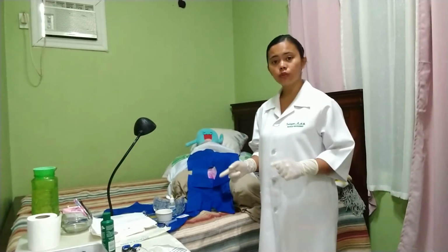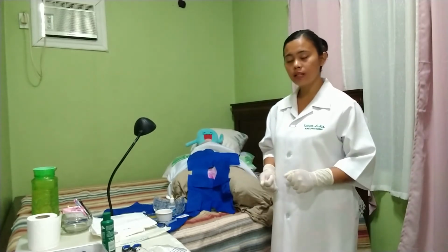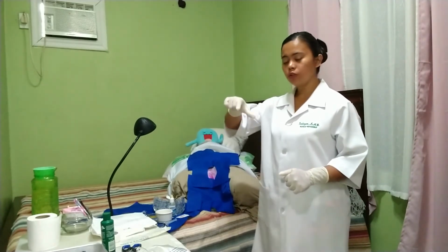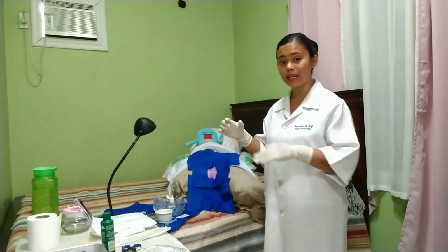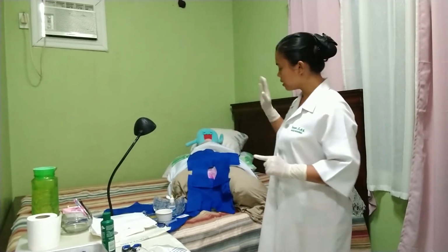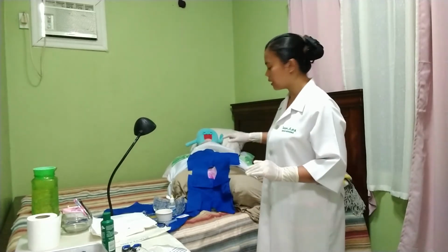We have to remember to discard the used cotton and not to cross them over our sterile field to prevent it from contamination. For women, we have to use our non-dominant hand, particularly our forefinger and our thumb, to hold the labia anteriorly, pulling it backward to expose the urinary meatus. Remember, we have to hold this position all throughout. Our non-dominant hand, once it touches our patient's skin, is already contaminated. Thus, we should not be using it anymore aside from holding that position.